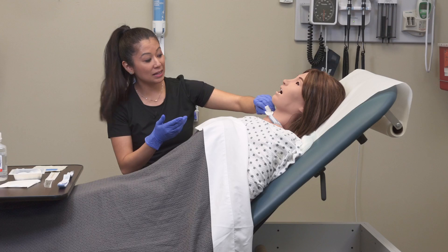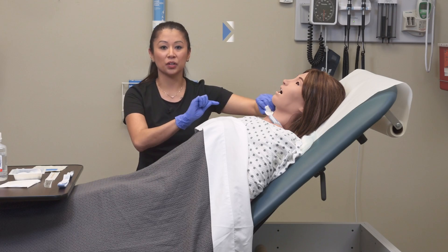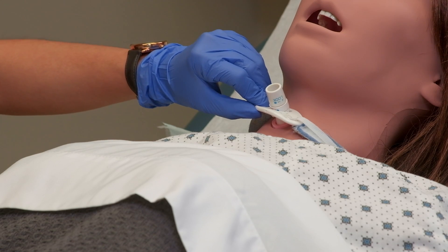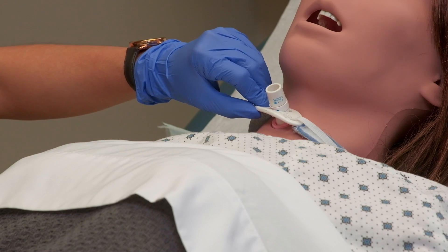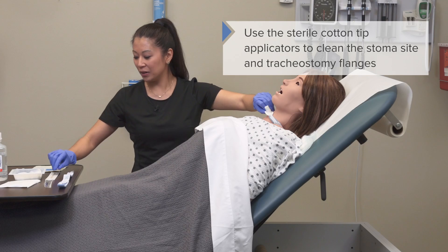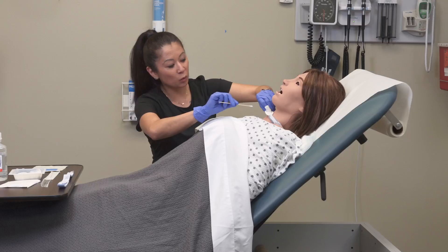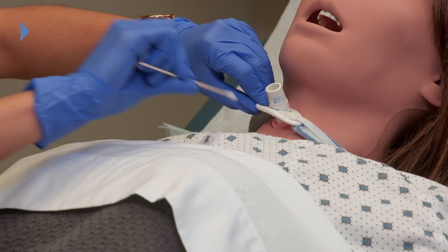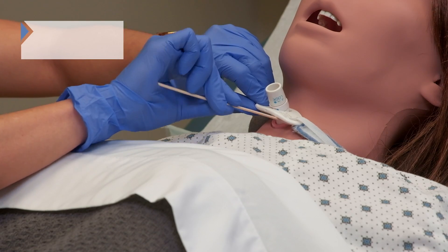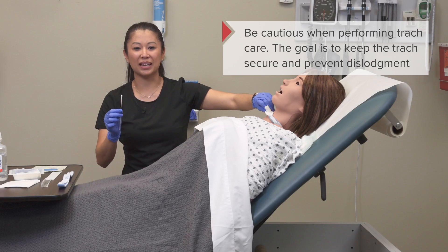Now that I've taken off that dressing and cleaned, I can see a little bit better underneath and assess that stoma site. Is there any excoriation, unusual drainage, signs of infection? We want to take a moment and look. The cotton-tip applicators are really helpful to get all the extra material off — I like to take one and go around the stoma site, then use another to get all the material underneath the flange.